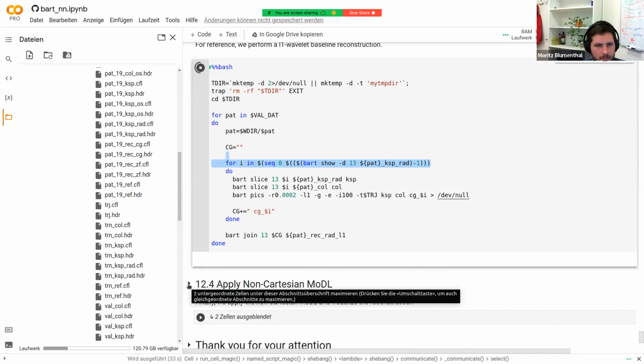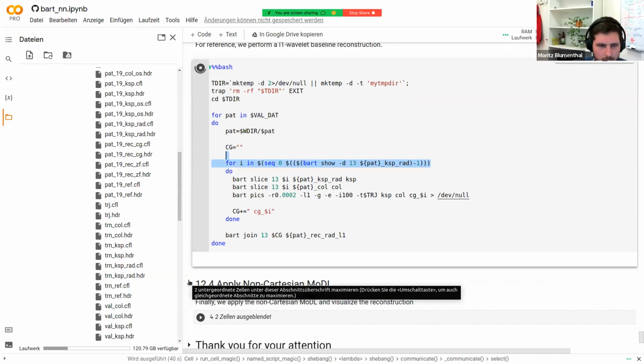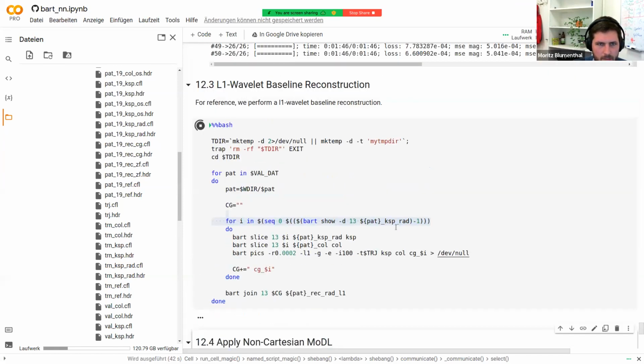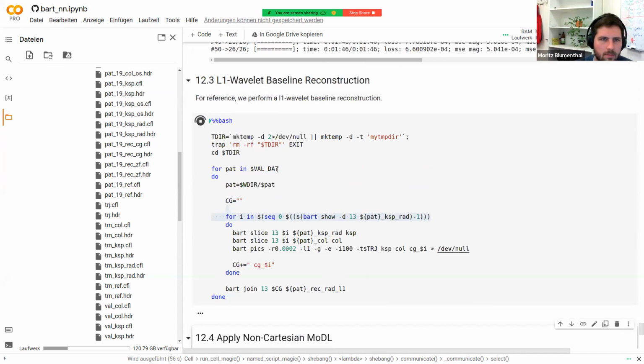And I just want to reiterate that I think another nice thing of seeing these demos is, we often get questions about how to do different tasks with BART, and these notebooks show great examples of how to string together several different commands, especially when working with multi-slice data, even if you're not intending to do exactly the same pipeline. So use these demos, grab code from it. Hopefully it will help you with your own processing pipelines as well.